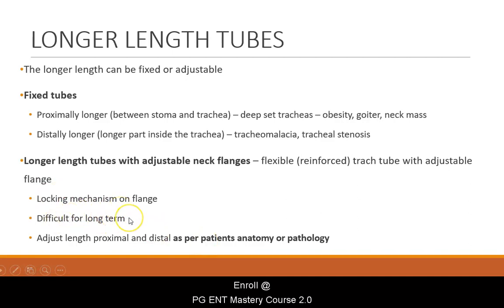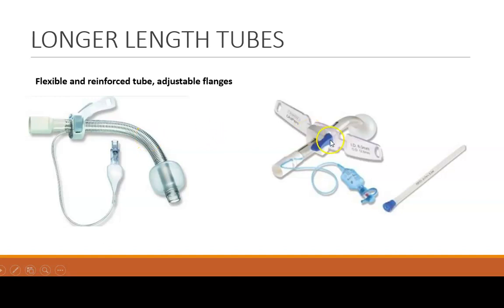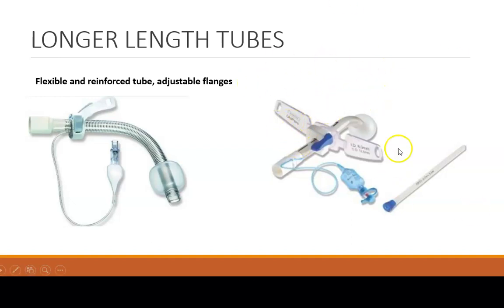The adjustable flange tube is not ideal for long-term use. You can adjust the proximal and distal length as per the patient's pathology or anatomy. Here you can see a flexible reinforced tube with adjustable flanges — pressing the grey area allows the flange to be adjusted up and down. You can turn a blue knob to adjust the length of the tube in a proximal and distal way.